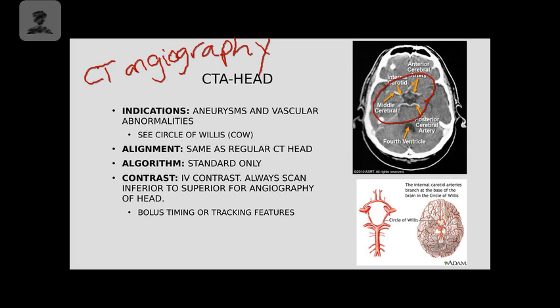If we see any kind of aneurysm or stenosis, we'll be able to identify that, and the radiologist can then make a diagnosis and determine what's next. A lot of times with patients that have strokes, we may introduce contrast to see where the stenosis is, to determine which artery itself needs to be opened if any kind of intervention needs to be done.